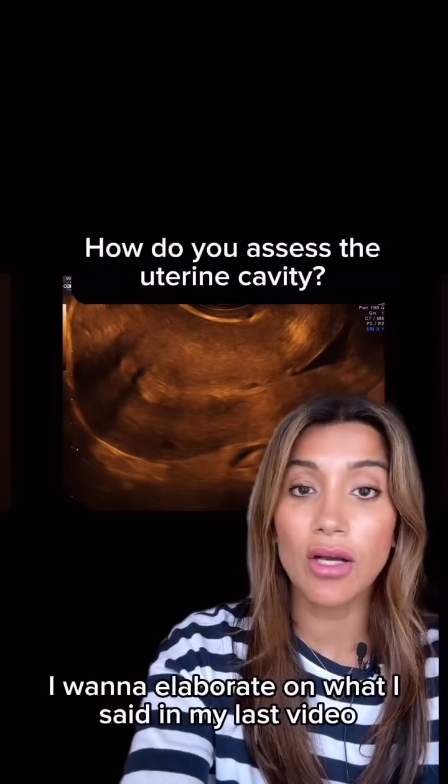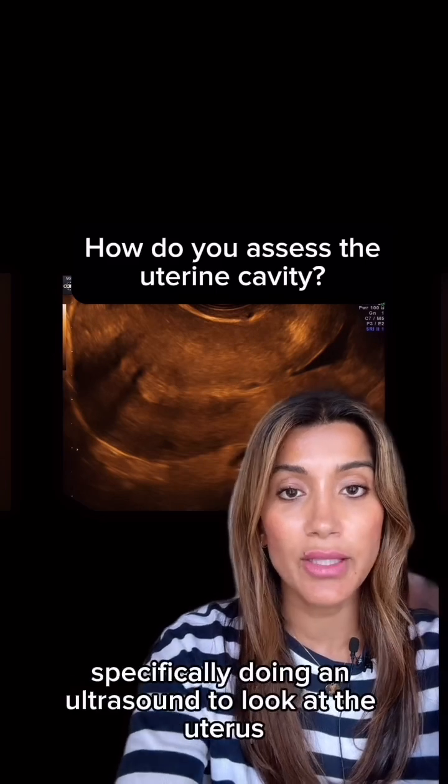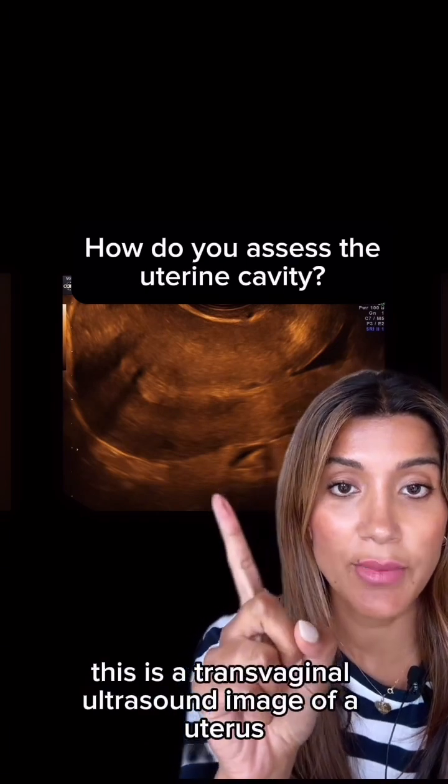I want to elaborate on what I said in my last video when it comes to fertility testing, specifically doing an ultrasound to look at the uterus. So let me start by orienting you. This is a transvaginal ultrasound image of a uterus.